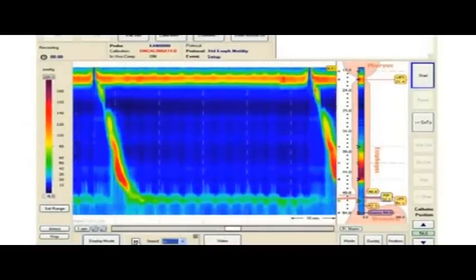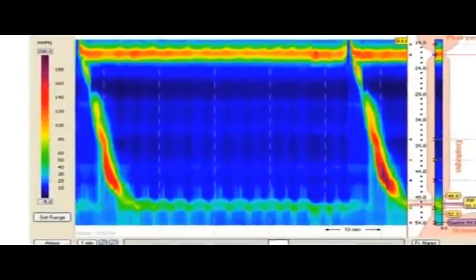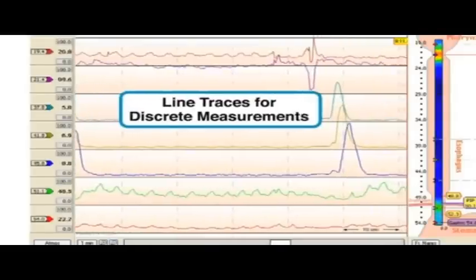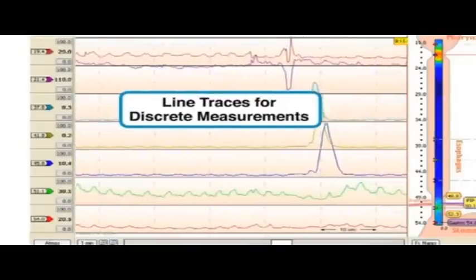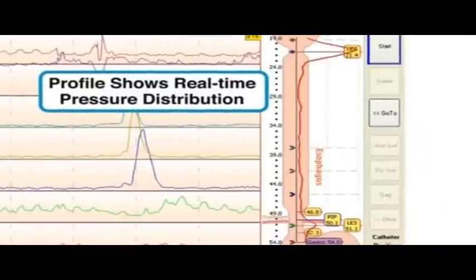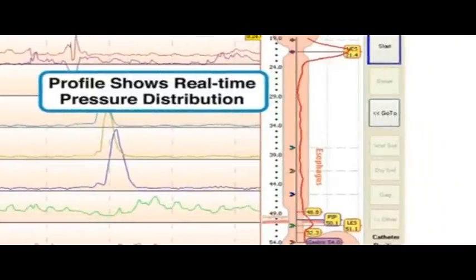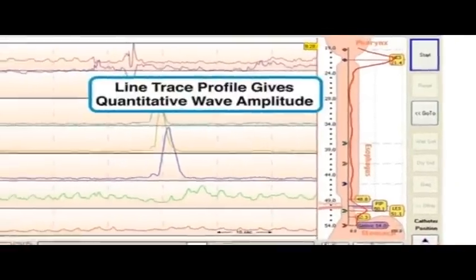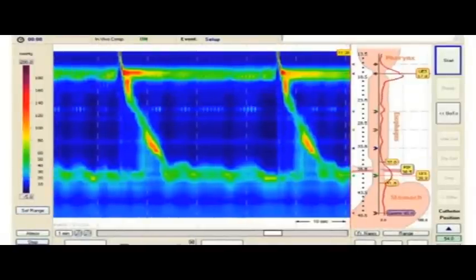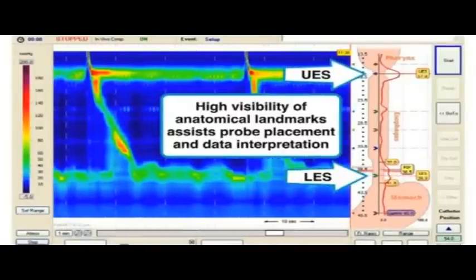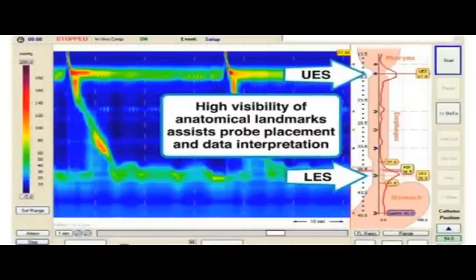The display may be switched instantly to view the same data set as line traces at discrete locations. The pressure profile may be viewed as a color map or as a line trace for quantitative pressure assessment. The high visibility of upper and lower sphincters assists in probe placement and data interpretation.